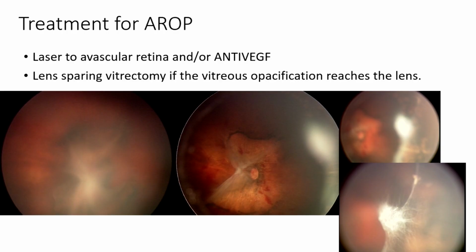Okay, this is the anterior hyaloid, which is organized. So this portion that you see is what you see in PHPV, the attachment of the central hyaloid stalk to the anterior hyaloid right behind the lens. So these remnants are seen. Okay.